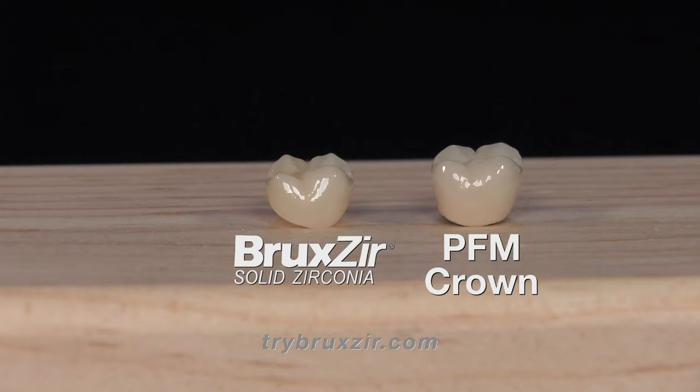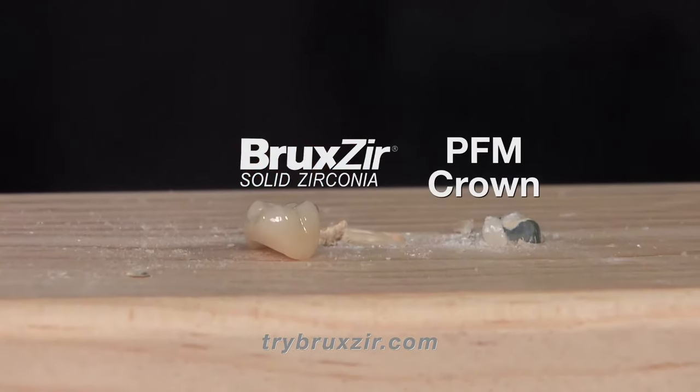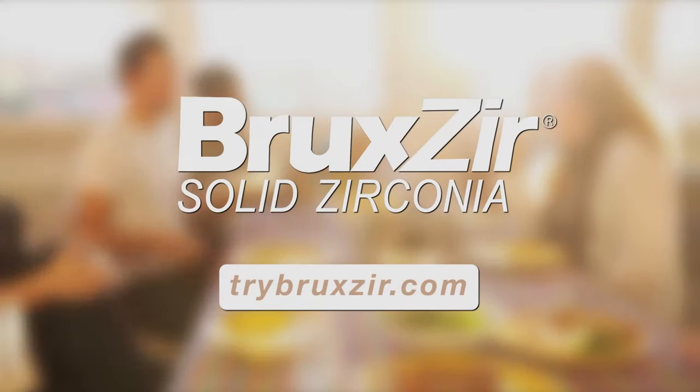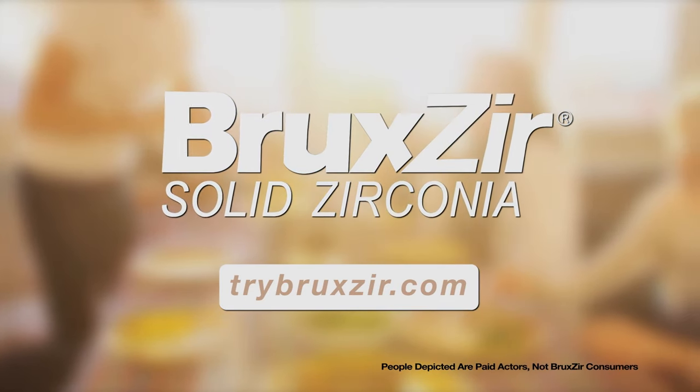Check out this hammer test and you'll see. Ask your dentist if your next crown or bridge can withstand the hammer test. Ask for genuine Bruxer Solid Zirconia. Log on to TryBruxer.com for information you can take to your dentist.